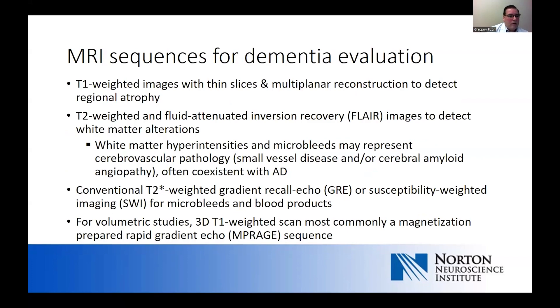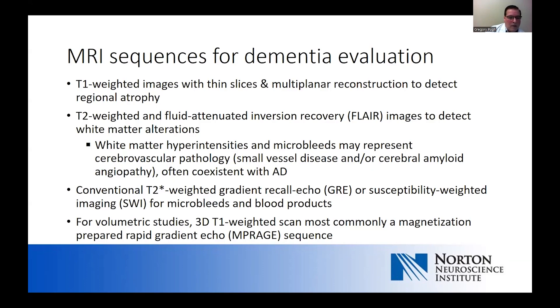Different sequences on MR provide different information. When looking at atrophy, T1-weighted images provide the most clarity in terms of global or regional atrophy. T2-weighted scans and FLAIR images are sensitive to vascular changes in the white matter. We see a lot of white matter hyperintensities and microbleeds representing small vessel pathology — due to hypertensive arteriopathy or cerebral amyloid angiopathy — and white matter changes often coexist with Alzheimer's disease. We also do quite a bit of volumetric imaging, requiring a three-dimensional T1 MP-RAGE sequence.